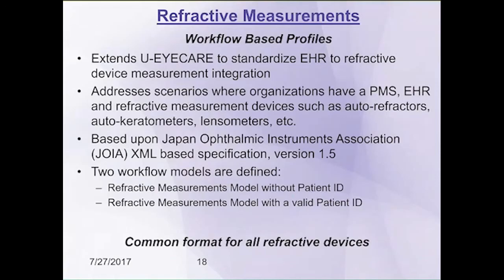As part of Unified IHE workflow, we've also added the capability for refractive measurements. What we've done is we extended the U-Eyecare for this capability. As we mentioned before, it's going to cover refractive devices such as autokeratometers, lensometers, autorefractors, and these type of systems. It's based on a specification called JOIA, Japan Ophthalmic Instruments Association, and it uses an XML-based data stream.